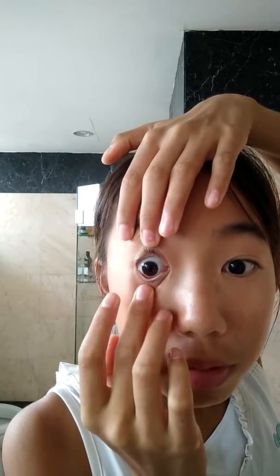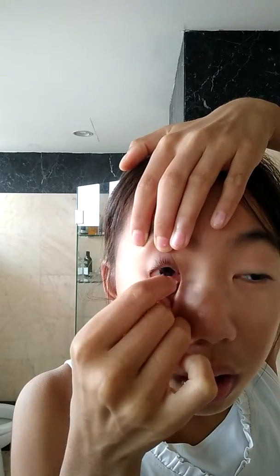After the clean and dry hands, take your left finger — if you're left-handed, use your right finger. Since I'm right-handed, I'm going to use my left hand, my middle finger. Look down, pull up, then use your middle finger, pull down, look towards your nose, and pinch. Your contact should come out just like that.